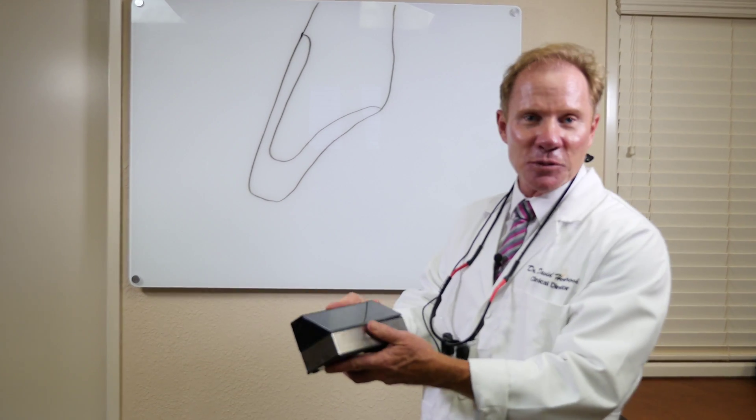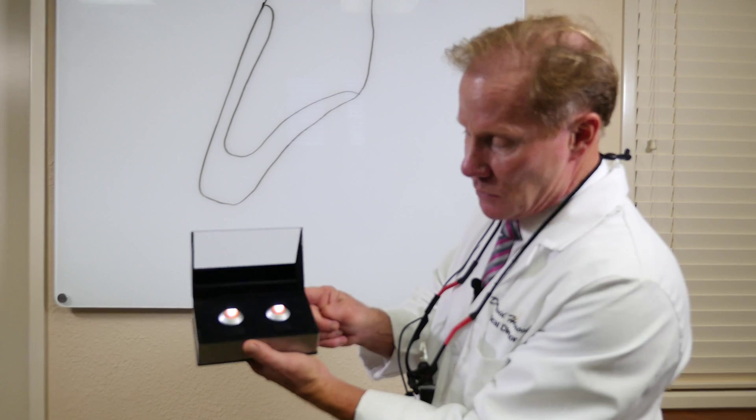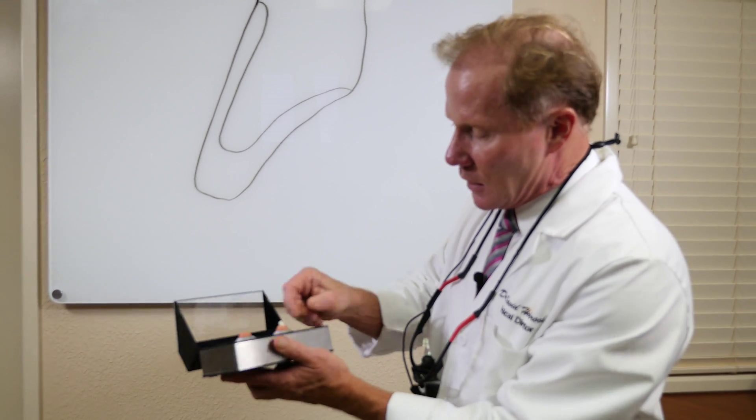I'm going to show something very cool with this new aesthetic material. This is a little box, originally designed for Procera from Noble Biocare. It has these little LEDs and little rubber tissue. The goal was to put a porcelain-fused metal crown where we see here, put it over that LED, and then you would take a Procera and stick it on top of that LED. When you lit it up, you would see light comes through the Procera, not through the PFM. Well, we don't use Procera anymore, but we are using zirconia. This is one of our new KDZ aesthetic material.